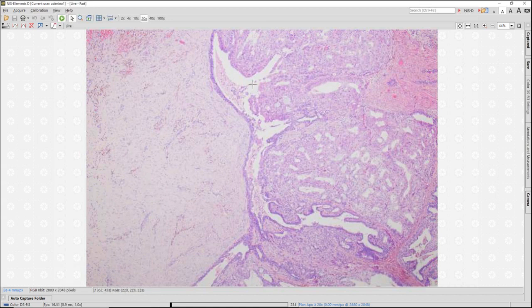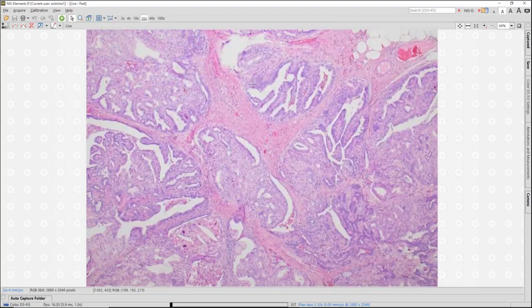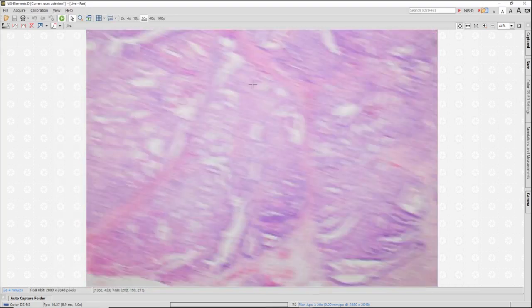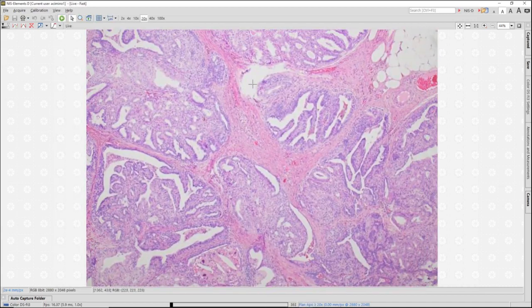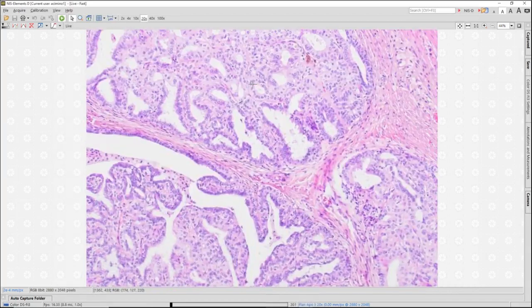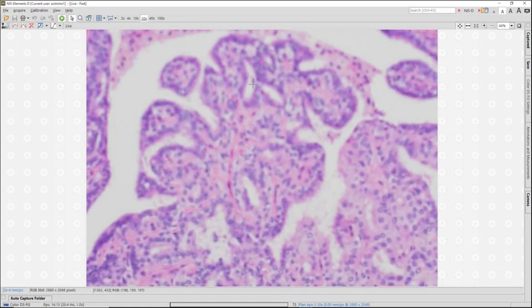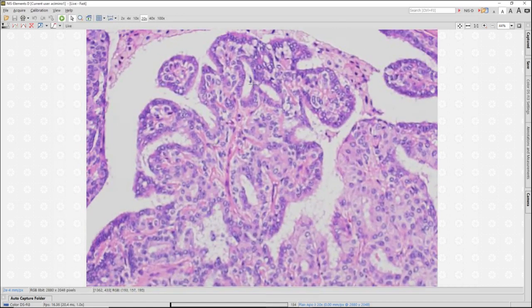Okay, so I'm dealing with a papillary lesion. I see that I have really mostly pink impression from low power. I see hyalinized fibrovascular cores, and then I see a lot of areas that show benign adenosis with back-to-back glands. Let me focus for you here, where we see the myoepithelial cell layer underlying the benign luminal cell layer around all of these glands.